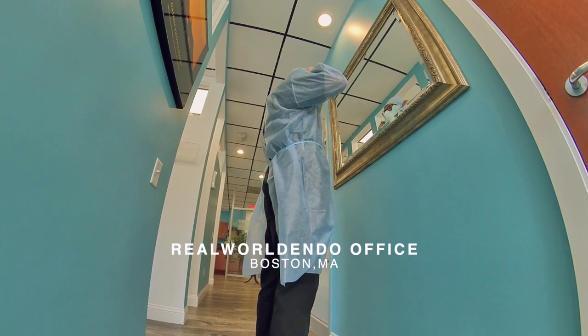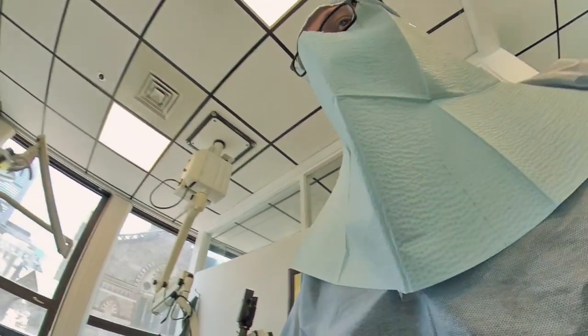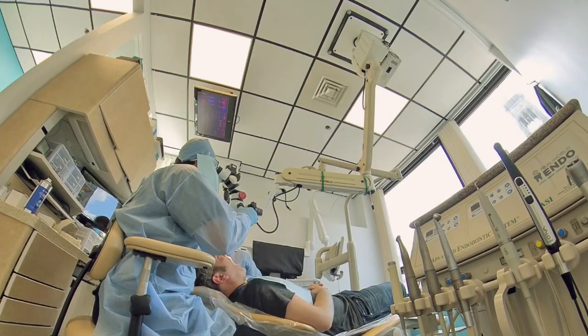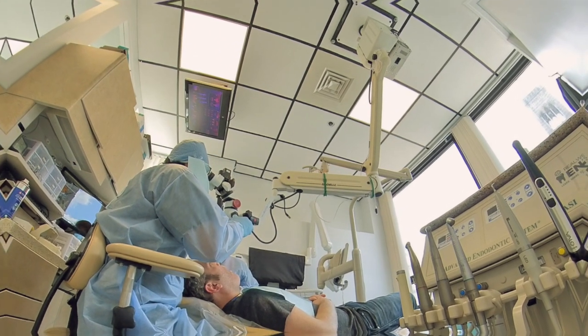At this point I also put up a patient apron and taped it to the bottom of the shield to give my neck a little more protection, because in the previous patient I wasn't getting enough neck coverage. Then we got started with the access preparation through the crown using the Dura-Cut Burr and the access kit to get through the crown as efficiently and safely as possible.